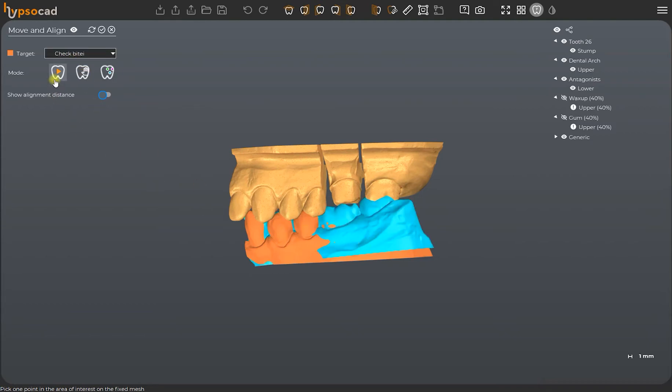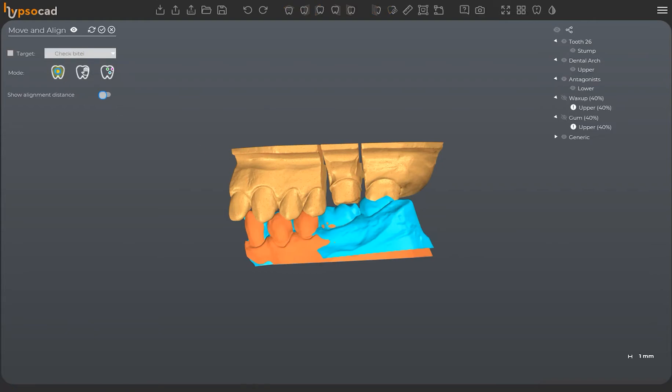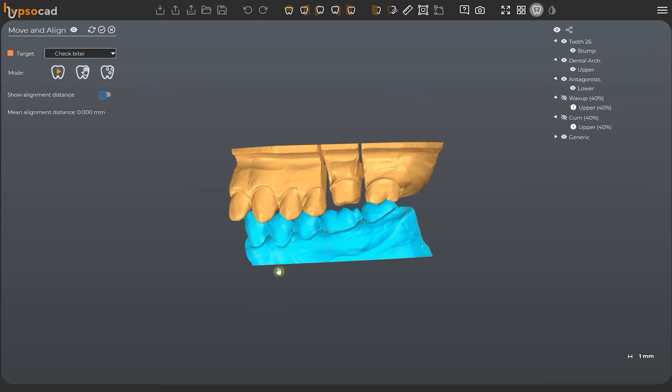We select the model we need to register. The color will change as you do this. At this point, we will have three alignment methods: Automatic, one click, and three points. It is possible to check out the correct alignment thanks to an optional color map and to assess the distance via a mean value.